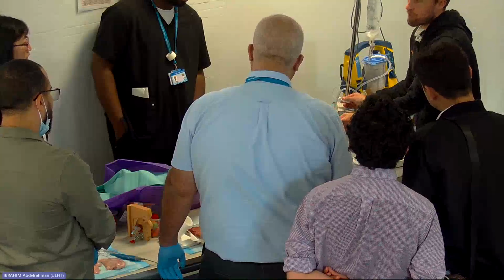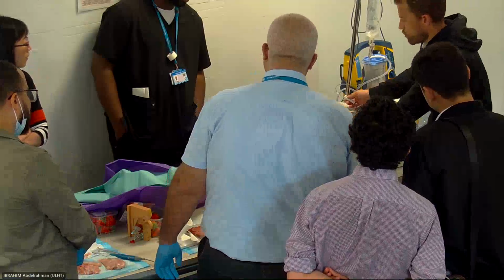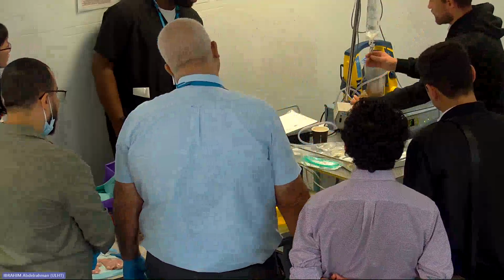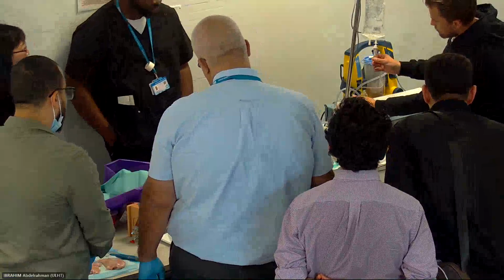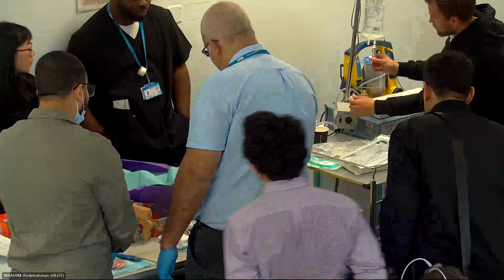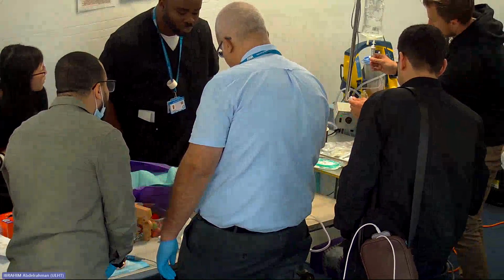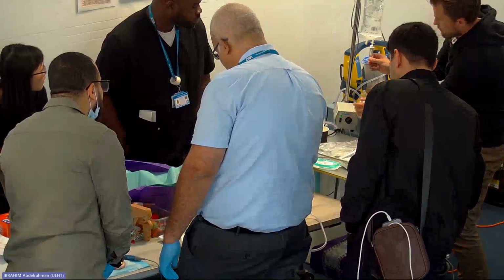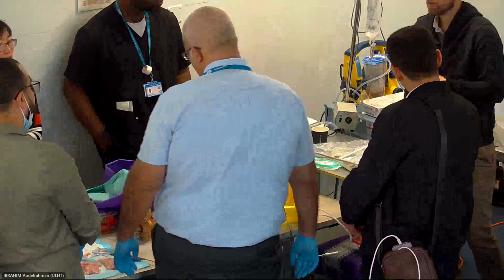Don't use the tip as an indicator of what your saline should be. Always look at this here. So if you put your foot on the pedal again, it should be a continuous stream of saline. Put your foot on the pedal. That's too much. You just keep reducing it. It's like a fast drip like that. Okay, so you want 2 or 3 drips a second.